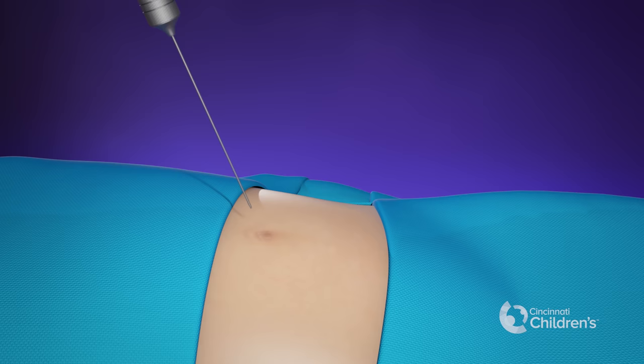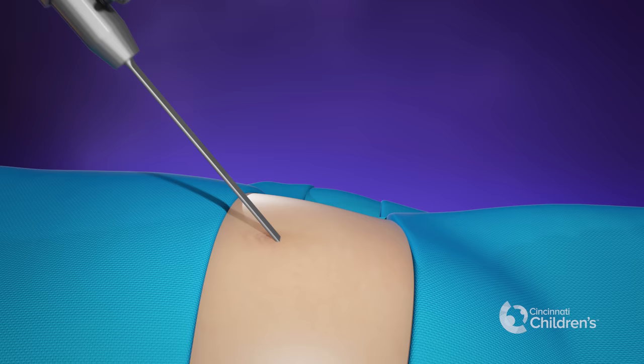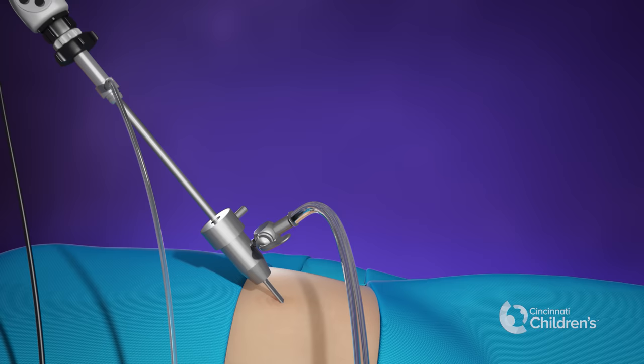A tiny needle is placed through a small incision in the belly button and used to inflate the abdomen. The needle is removed and an instrument guide, also known as a trocar, is placed through the incision into the abdomen. A camera is then inserted and is able to watch two additional trocars as they are placed in the right and left lower portion of the abdomen.